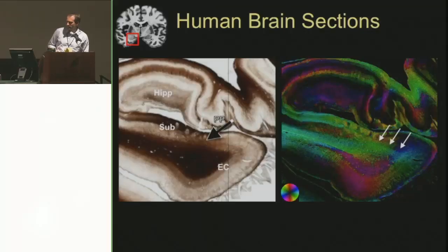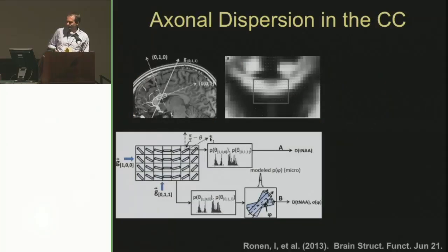Even looking at the medial temporal cortex here, one can appreciate fibers emanating from the hippocampus, in particular the subiculum. This small structure is the perforant path, which is one of the first pathways implicated in Alzheimer's. So we can even pick up on something like this. There are several diffusion studies that have purported to detect this pathway in vivo or ex vivo, so it might be another way to validate some of those studies.